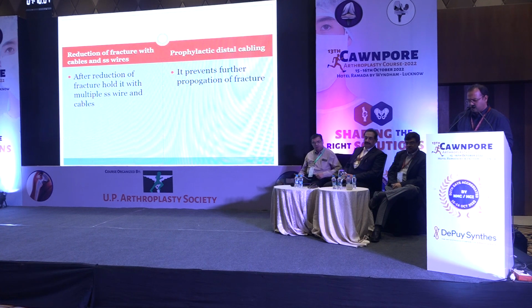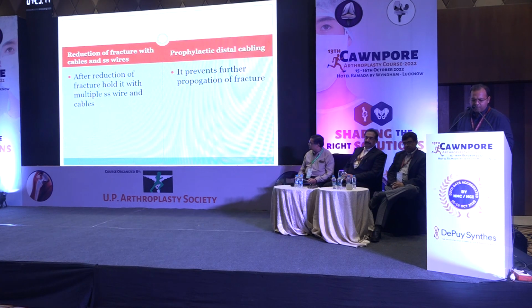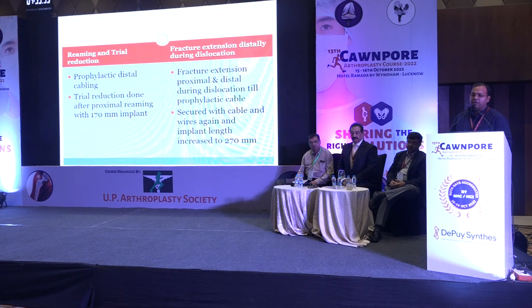So after having this construct in place, in which there is a single whole, it was like any normal THR, in which you put a stem and then reduce it. After reducing it, I also did a prophylactic distal cabling so that the fracture does not propagate further. So everything was well. I put in a 170 mm implant and trial reduction was done.